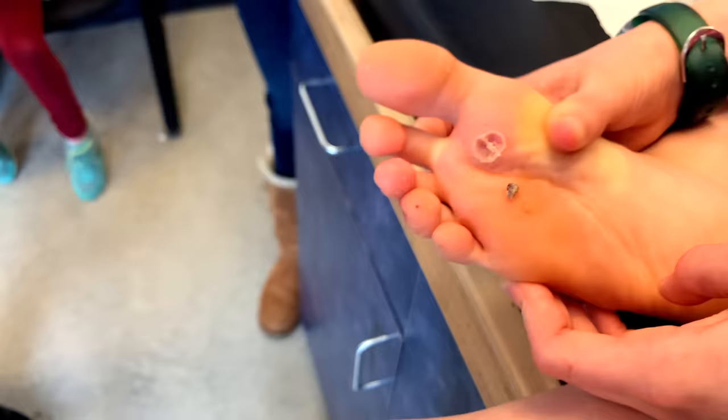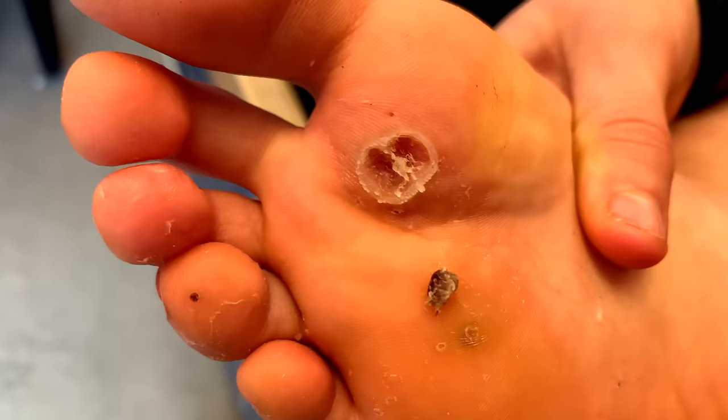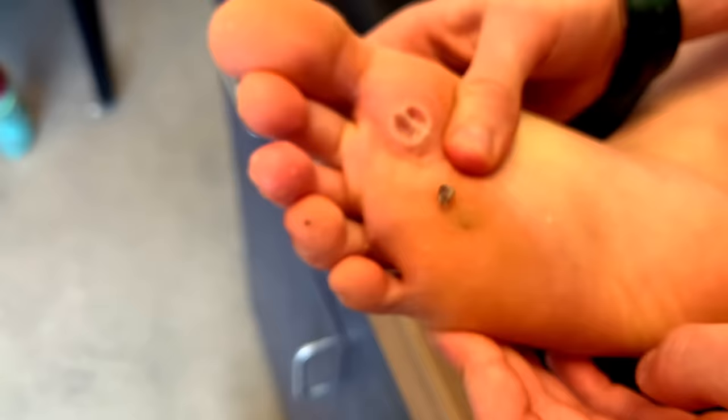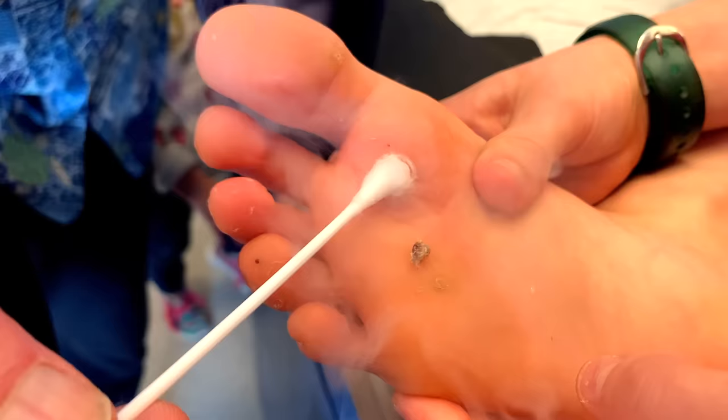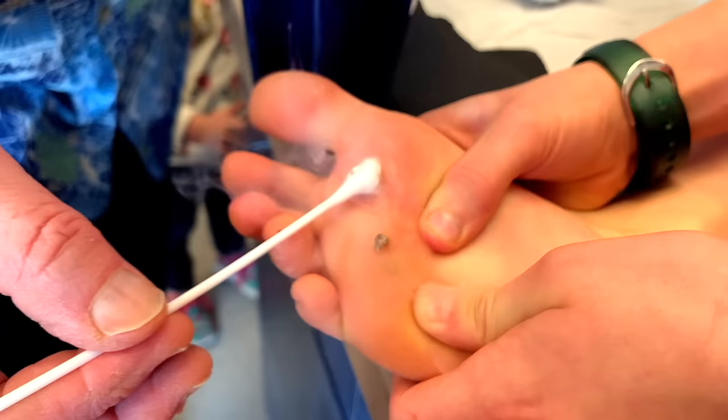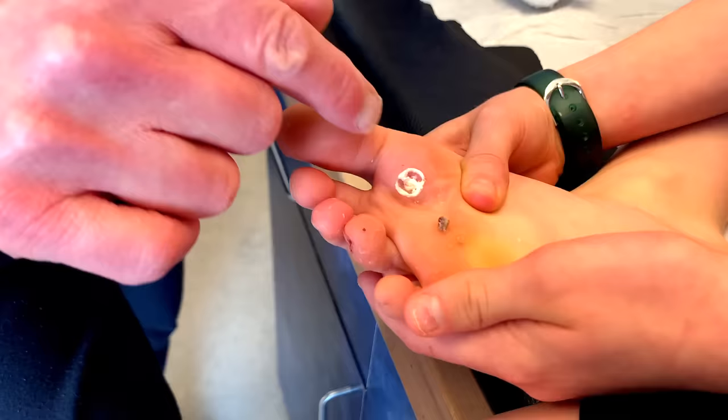Now what we're going to do very briefly is just freeze the base of it in case there's some wart virus left down there. So we did amazing — this is going to be the most impressive wart video in the world. This is liquid nitrogen and it's cold. Can you feel the coldness? Ow! Alright, we're going to leave it at that. Now it's frozen white like an ice cube.